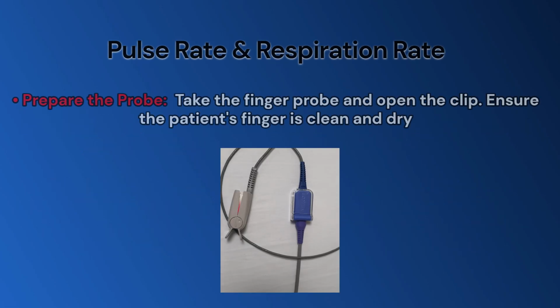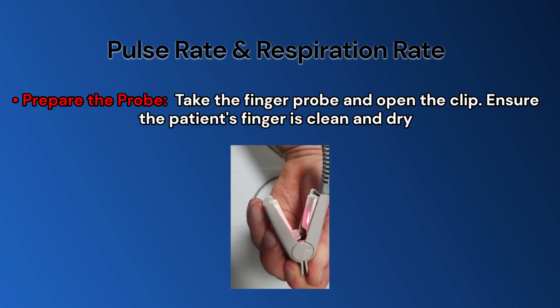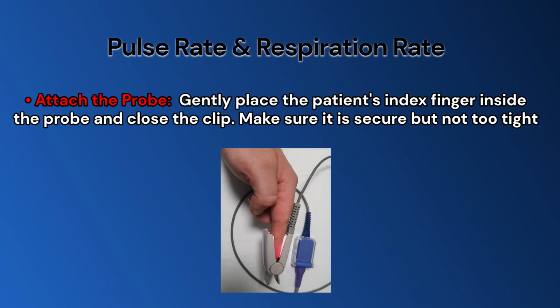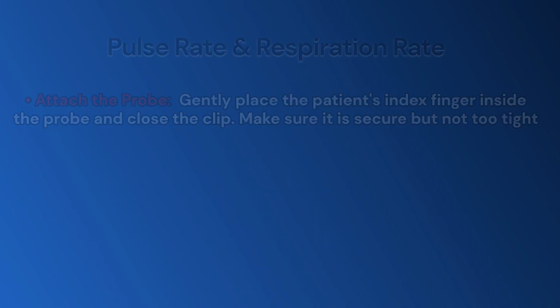So, prepare the probe. Take the finger probe and open the clip. Ensure the patient's finger is clean and dry. Attach the probe. Gently place the patient's index finger inside the probe and close the clip. Make sure it is secure but not too tight.